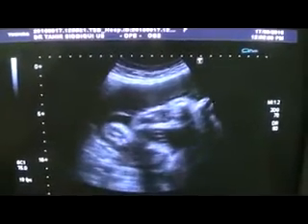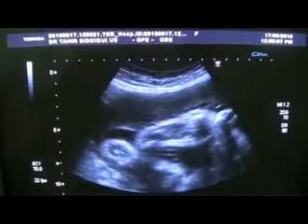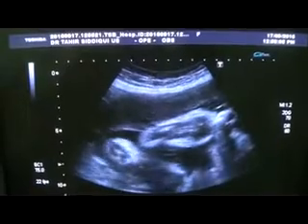This is an obstetric case study. I'm showing you that this is a female fetus. These are the two femurs and this is the sex of the fetus.